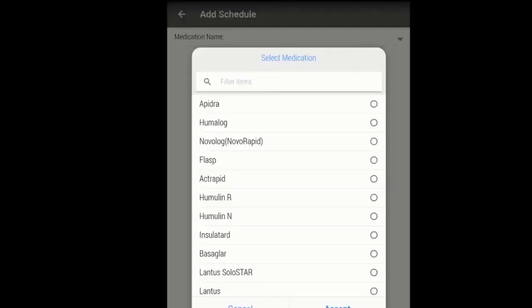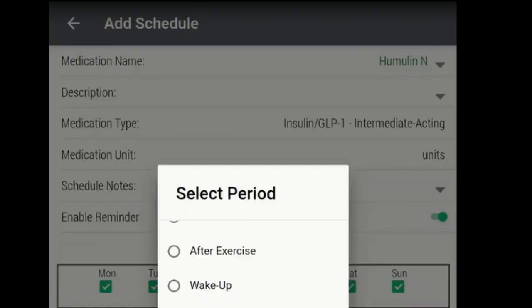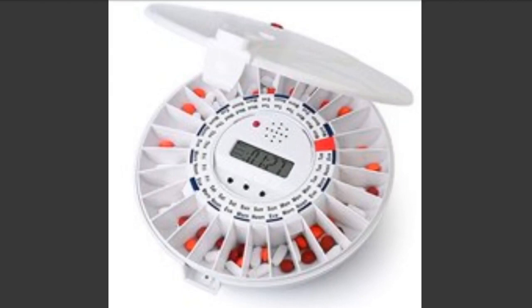Medication Schedule and Reminder can text the notice or create an automated phone call letting the user know what medication should be taken and when. The app can also inform a third party that the medication may not be taken as prescribed based on the collected usage report. Smart Health One-on-One offers a pill dispenser as part of the Home Monitor lineup of products.